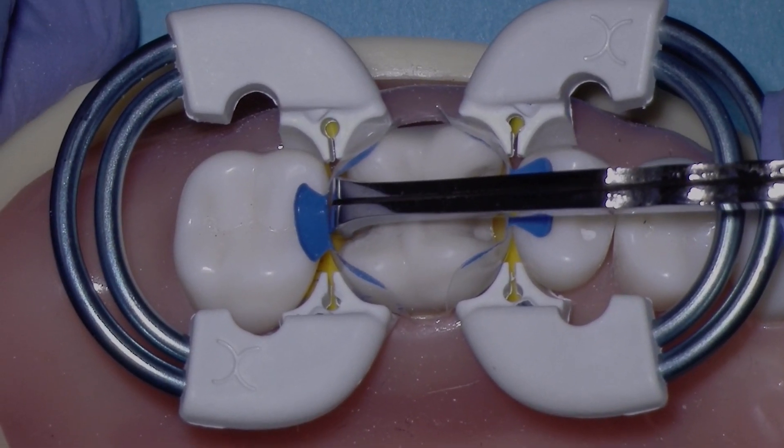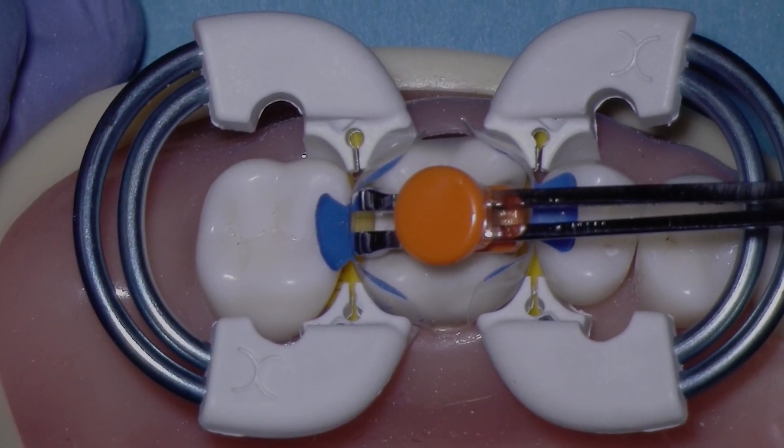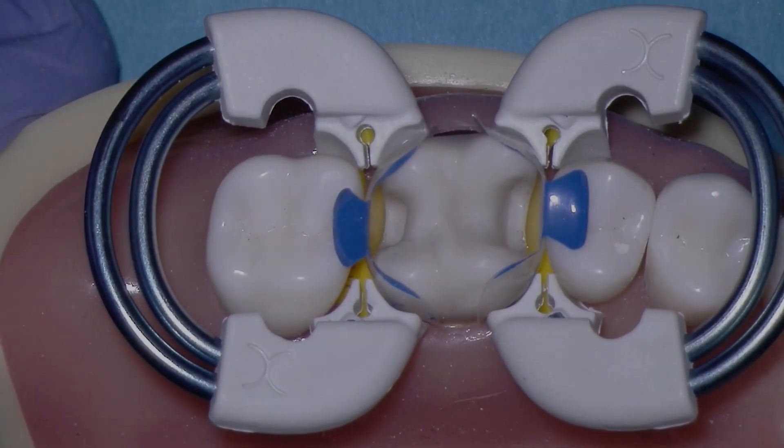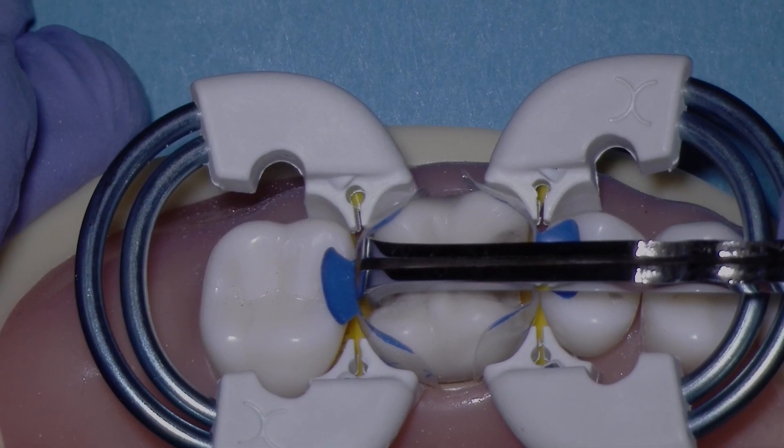My preference is to always use the adjustable end of the instrument if I can, because I can really control the buccal-lingual dimension with the two hands. But for smaller preparations, you're going to need to use the small end of the instrument.